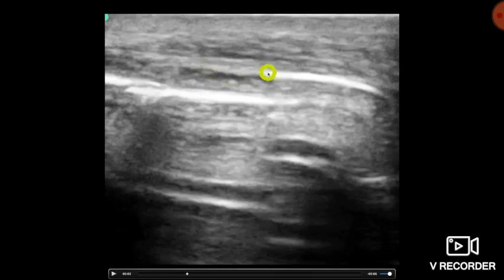You can see that right starting right here, we can see an enhanced peritoneal stripe. It's brighter than what's next to it. And we have some reverberation artifacts, some A lines right there. Now contrast that, which is free air, to this down here.